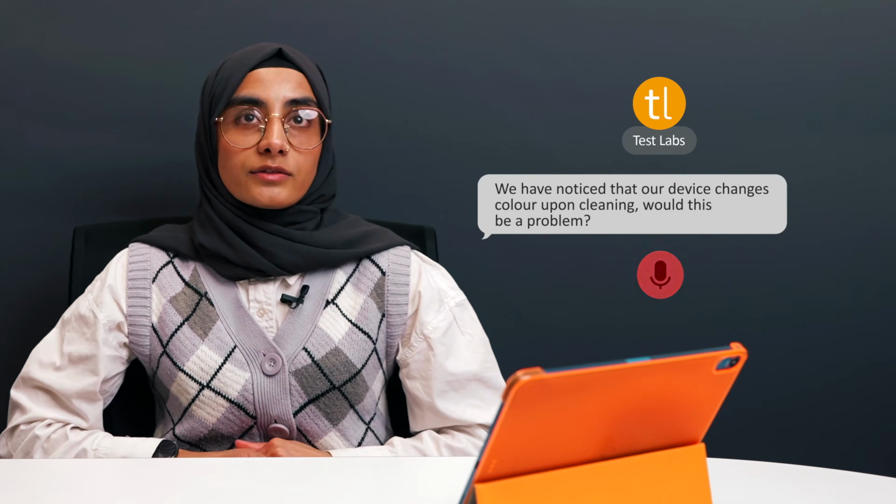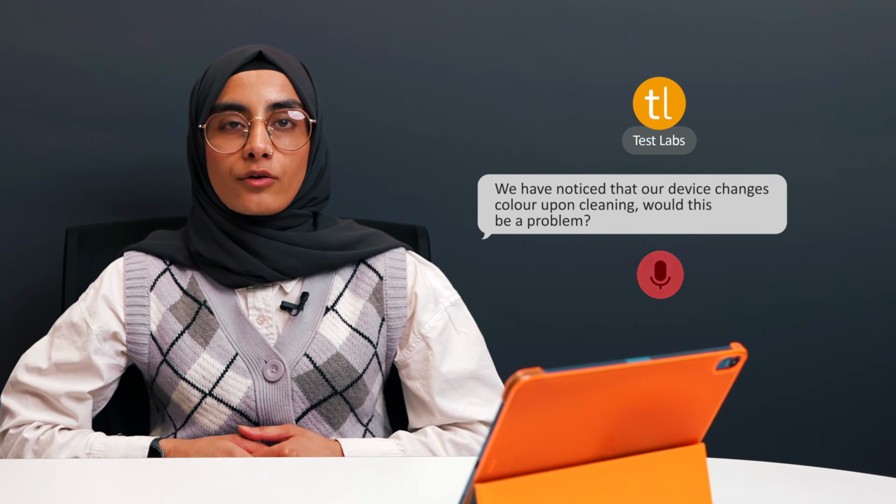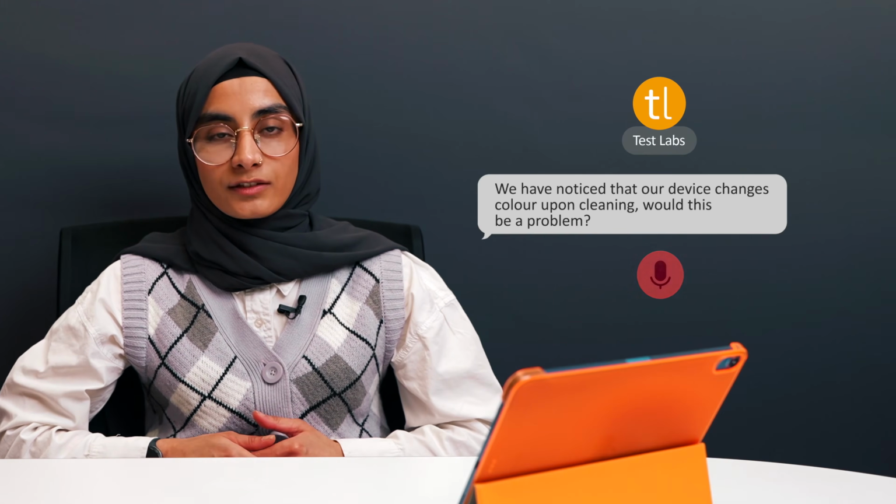We have noticed that our device changes color upon cleaning. Would this be a problem? So it depends at what point you had started seeing this discoloration. If it's towards the end of the lifespan of the device, then it's probably not going to cause much of an issue because the device is going to be put out of use soon anyway.